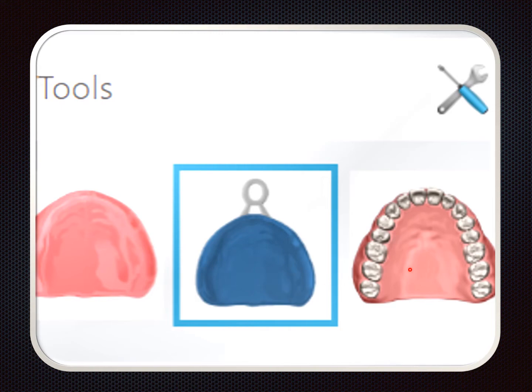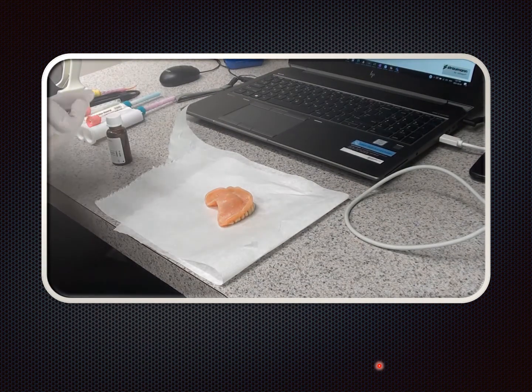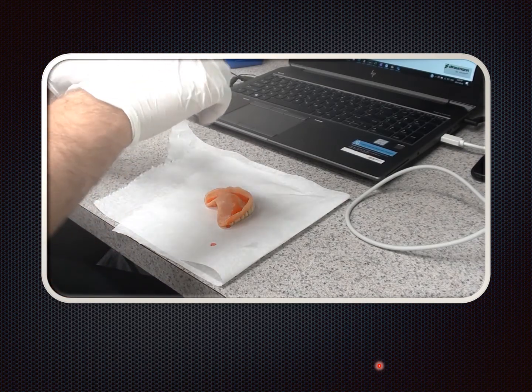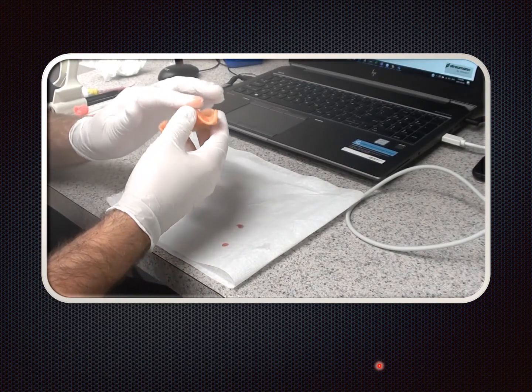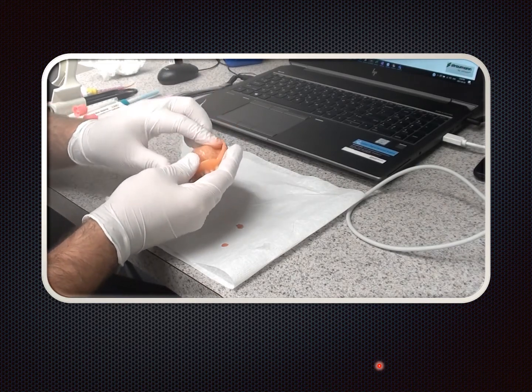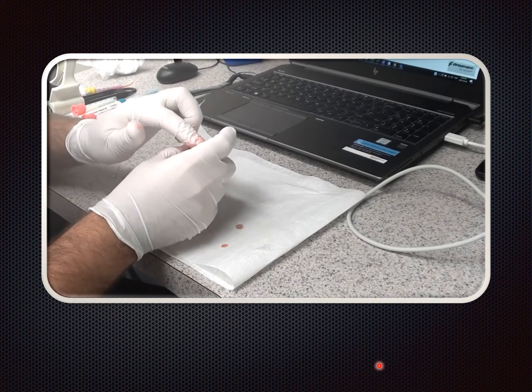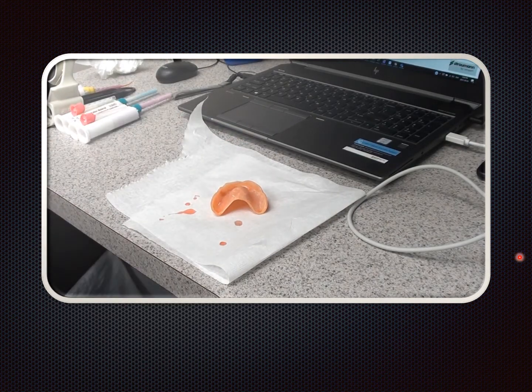I'll be using a slightly modified technique for this. The first step is to apply the tray adhesive. The manufacturer recommends letting it set for 5 to 15 minutes. I like to apply it and then move to other procedures while it's setting. I liberally apply it — pouring it in, using my finger to spread it around, making sure I get it everywhere, including the facial surface, so it won't peel back.